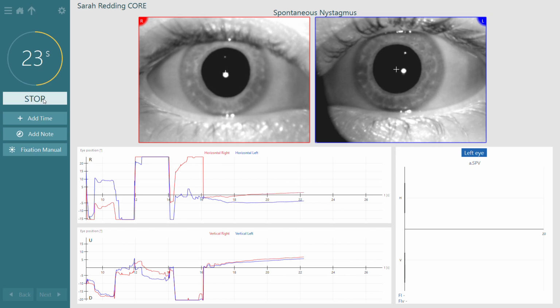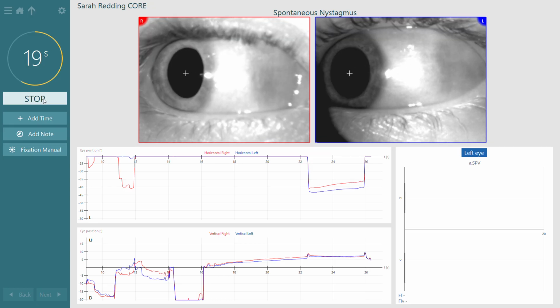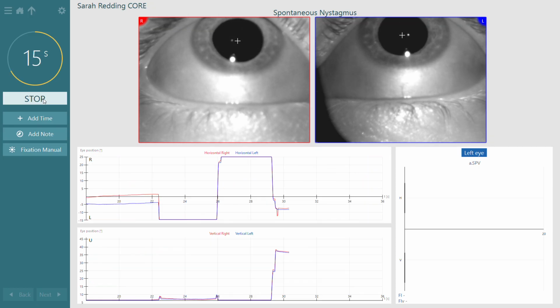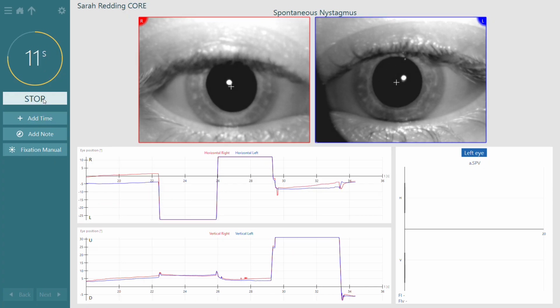So we could say look to the left. Good. Again, you want them to keep their head still. Look to the right. And look up towards your forehead. So we can just get some different motions in a vision denied condition to compare to the vision enabled.